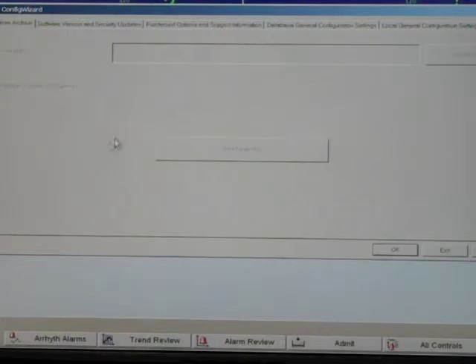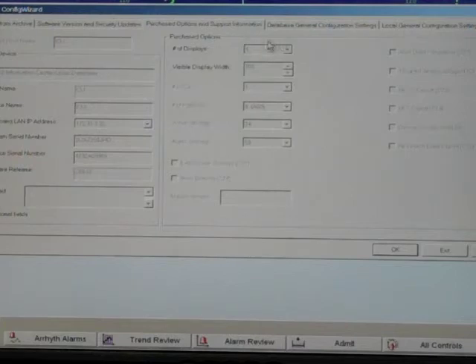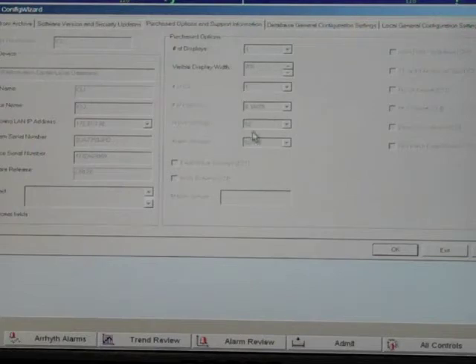Click on the purchased options and support information tab and verify that the number of displays, the number of patients, and wave storage options match your purchased system's configuration.